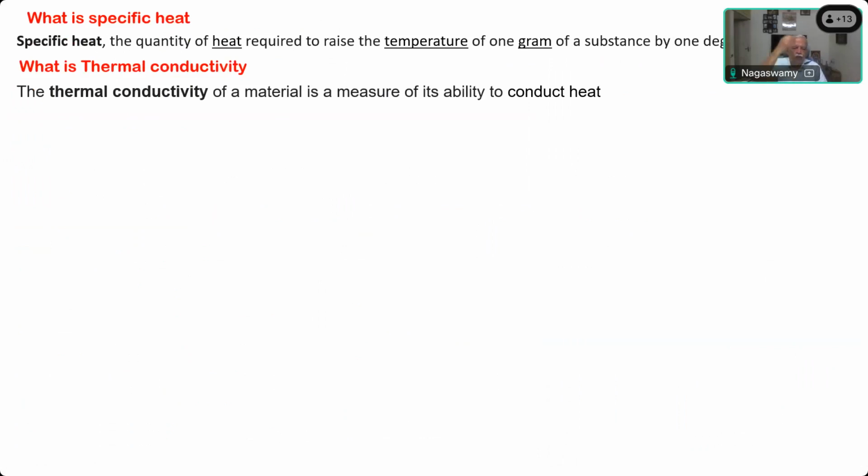So the specific heat and thermal conductivity both are in relation to the material out of which we are going to make or construct our vaporizers. It is not related to the volatile anesthetic agent that we are going to use for anesthesia. Only latent heat of vaporization is applicable to the liquid agent that we are going to use. The specific heat and thermal conductivity are applicable to the material out of which we are going to construct our vaporizer. Is it clear? Right.